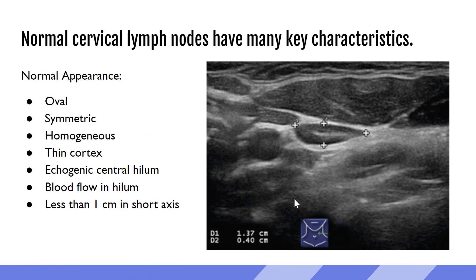Normal cervical lymph nodes have many key characteristics. This includes taking on more of an oval shape as opposed to round. We're looking for them to be more symmetrical — do they have an even cortex that's thin and homogenous all the way around? We also want to identify a very central echogenic hilum. We're going to use color flow on any lymph nodes we are evaluating, hoping to see just one artery and one vein coming into the hilum. When we measure on the short axis, we expect them to be less than one centimeter in width. Here we have an example of a very normal appearing lymph node in the neck.